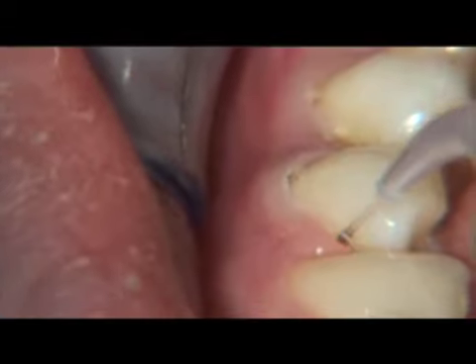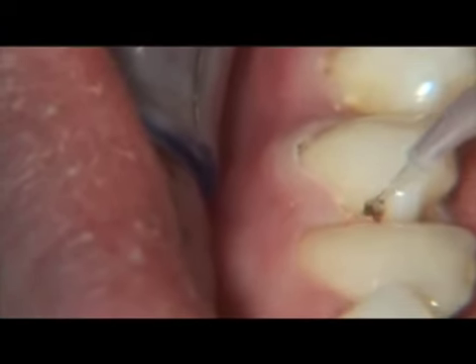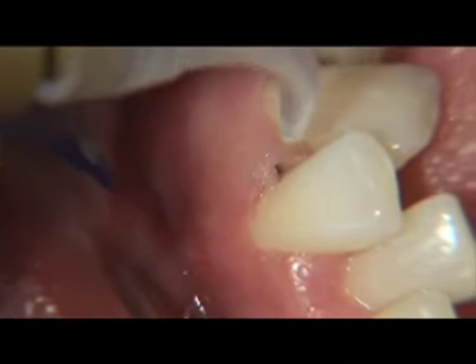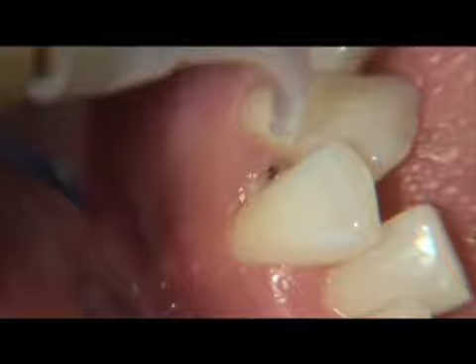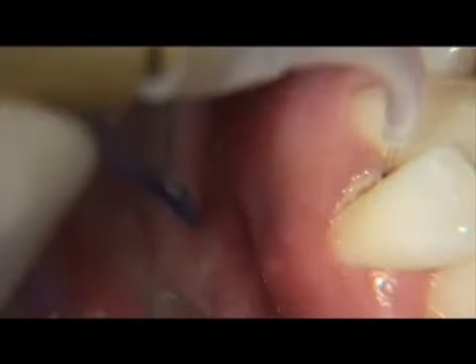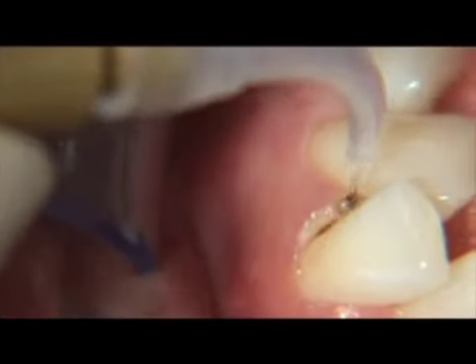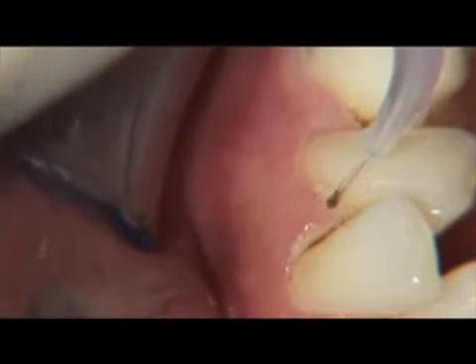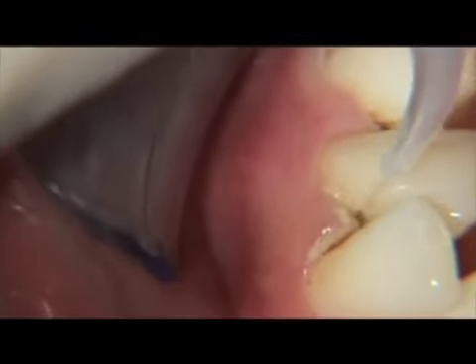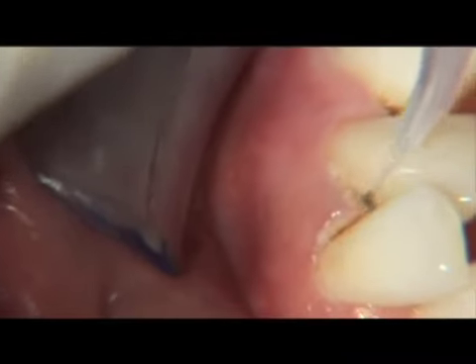Laser curettage can take anywhere between 30 seconds to more than a minute in order to cover the entire circumference of each tooth. The amount of time that it actually takes per tooth depends on the depth of the pocket and where the pockets are located. Interproximal areas will take longer than facial or lingual surfaces. Lower anterior teeth will take less time. Molars, especially with furca involvement, will take more time.